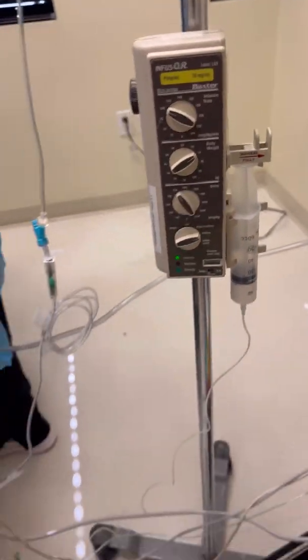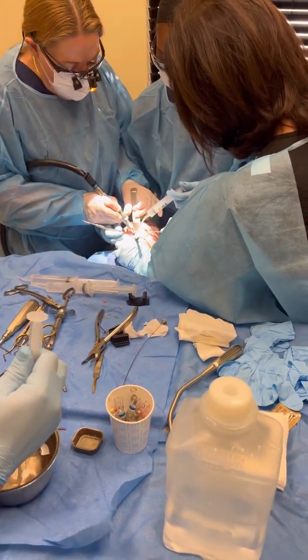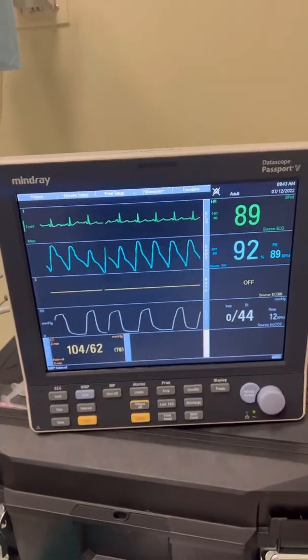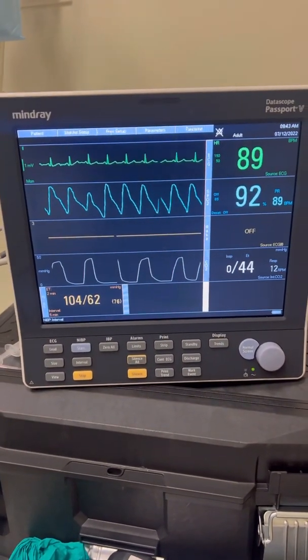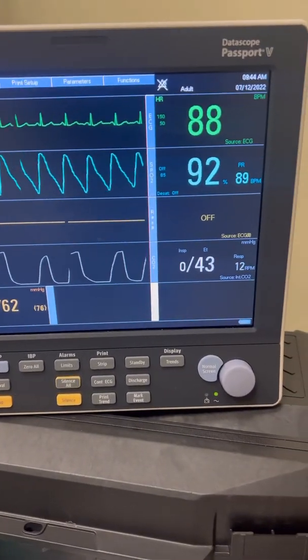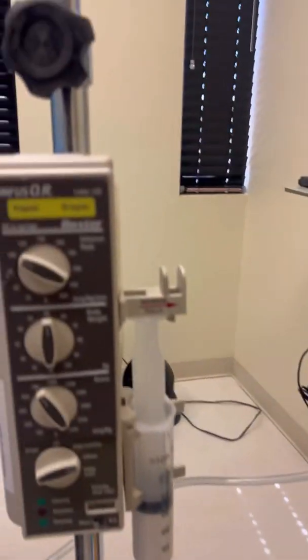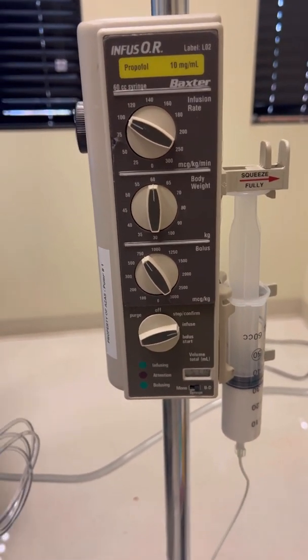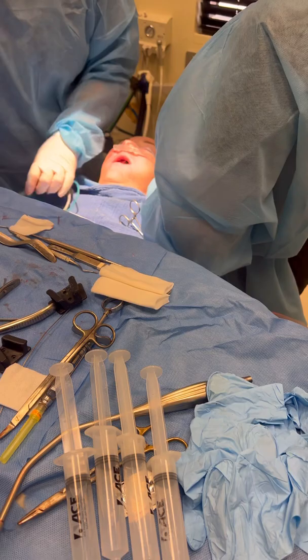She's breathing very nicely. I've worked in some Presidex — I gave her a little fentanyl, gave her some Versed obviously to start, some fentanyl, propofol. Then I worked in some Presidex, and look at how Presidex works — it works magic. Sometimes you do got to be careful though, because it can sneak up on you and really bring that blood pressure down. I don't want her blood pressure to drop too far, but right there I was very comfortable with it.